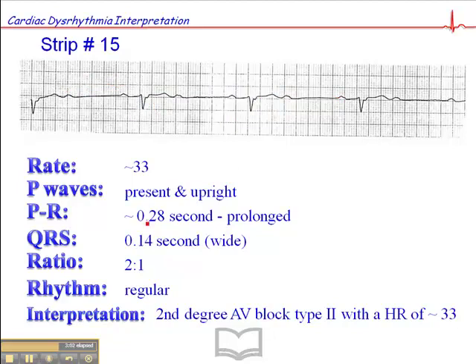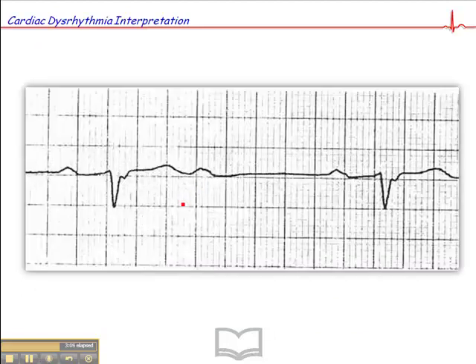And if we look at this next enlarged version of the same rhythm, so the big question here is where is the QRS, where is the T wave, where is the P wave? Well this is a P wave clearly. This must be the QRS and following the QRS is ventricular repolarization, and that's what this is here. That's a T wave there. So this is a T wave and this is the P wave. All of this here must be the QRS. That means that the QRS begins here and ends about here.